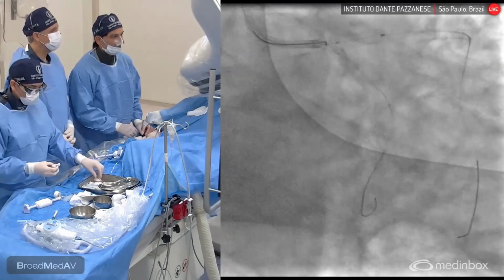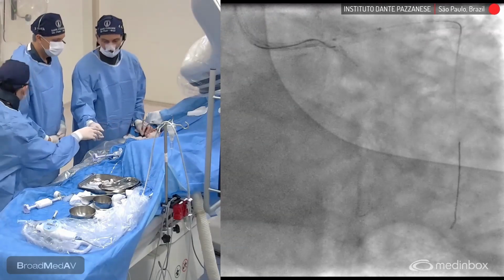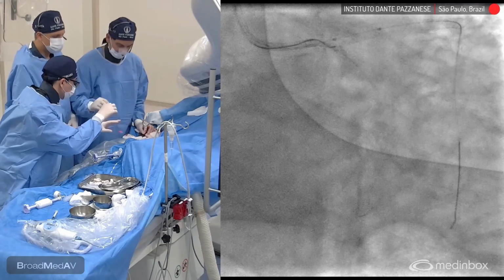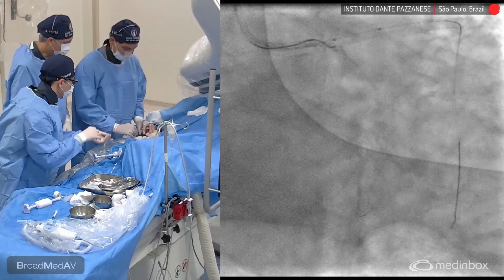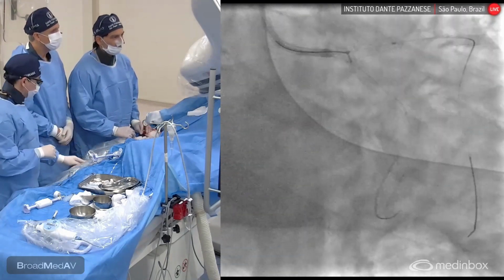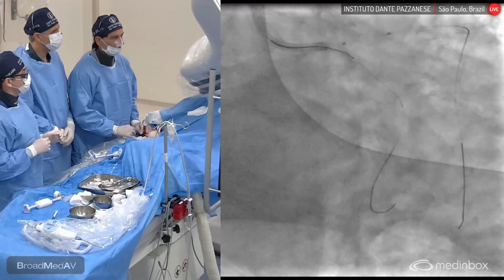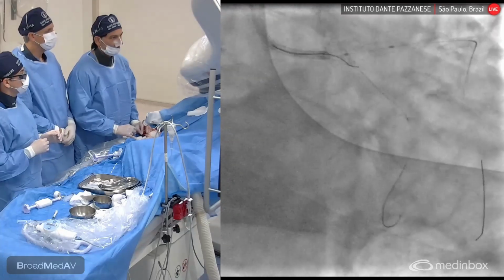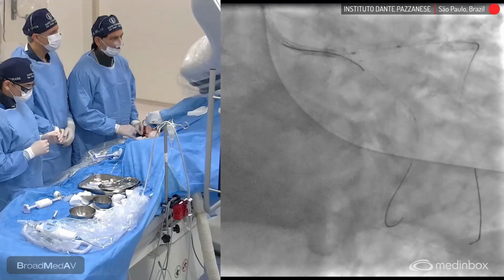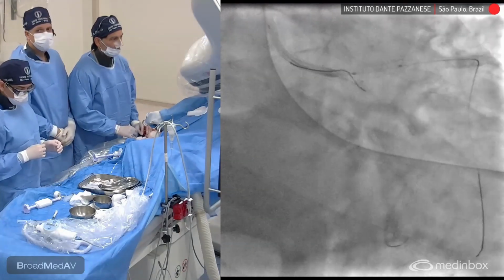Or you should remove the wire and try to get another cell, because sometimes you get just one cell, one angulation that does not let anything go down. This is part of the business of bifurcation. So you're trying to recross here. That's a different location. It's not that difficult to recross, but you might have to do some extra work.